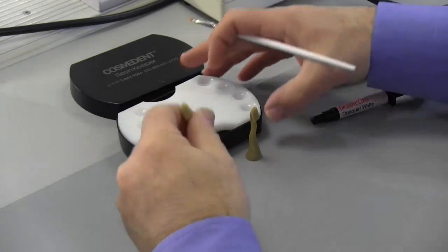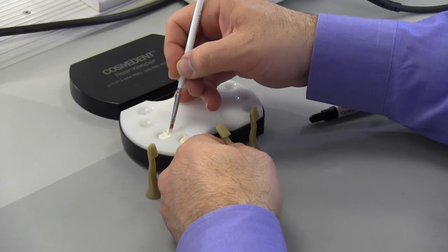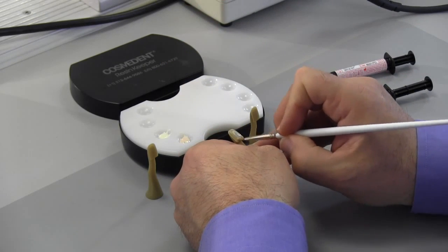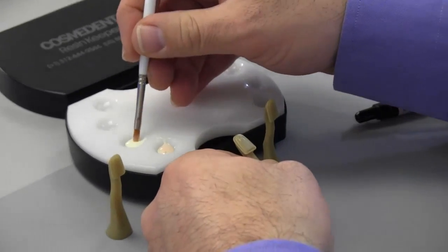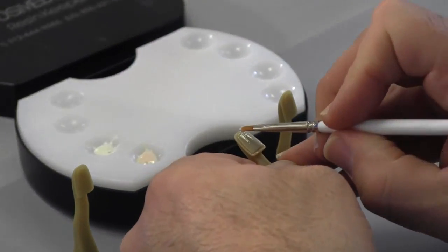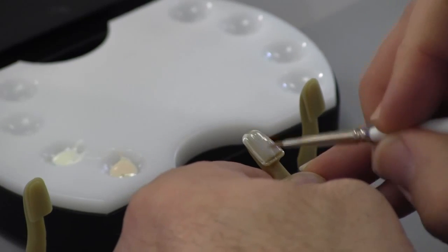After you etch and bond the tooth, you're going to take your white opaque, or what most doctors do is they take their white opaque and put a thin coat of opaquer to neutralize that gray, dark brown, or metal. If you notice, you can see the flatness or the brightness of this opaquer.